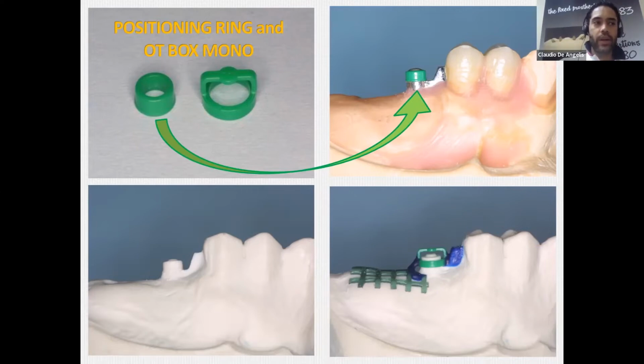Because the retentive cap is not intended to be duplicated, when you produce the metal frame, the tolerances will not be correct. So to do a state-of-the-art job, you need to duplicate the positioning ring here.